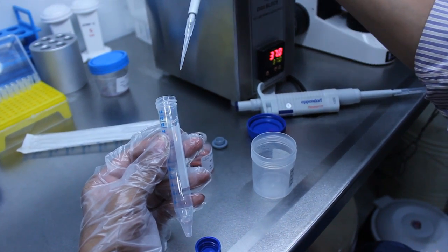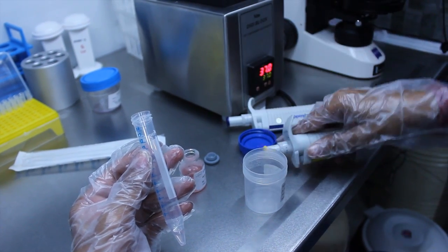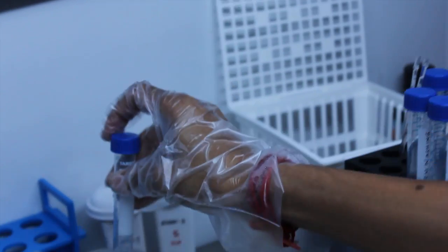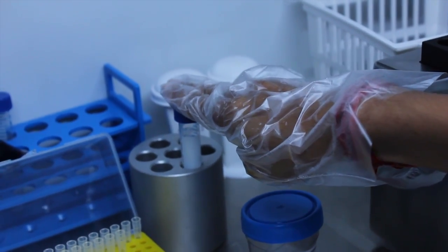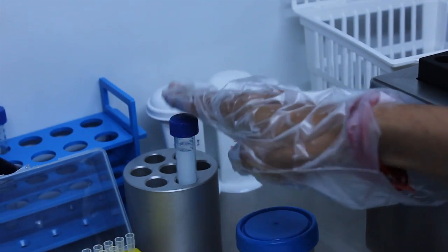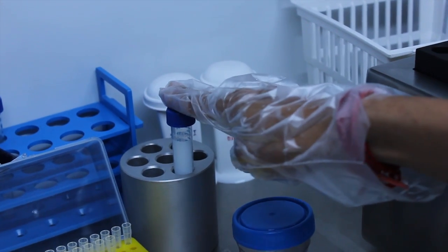The sperm freezing media is not kept in the heat block. It is rather kept outside to come to normal temperatures. 37 degrees centigrade is not required for sperm freezing media.